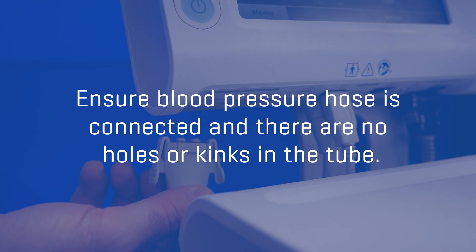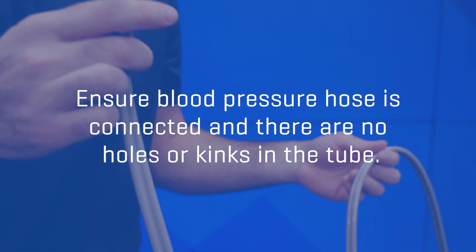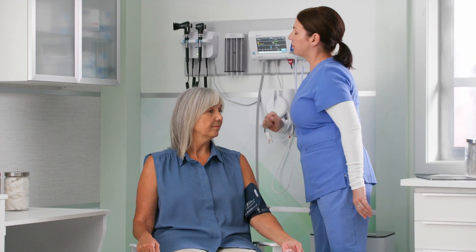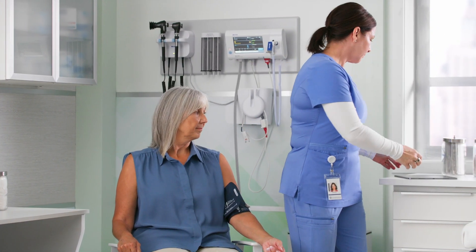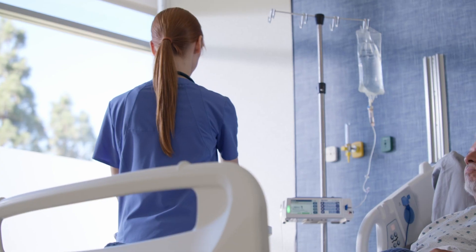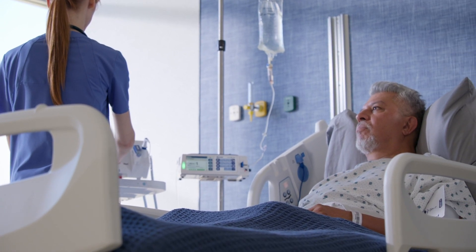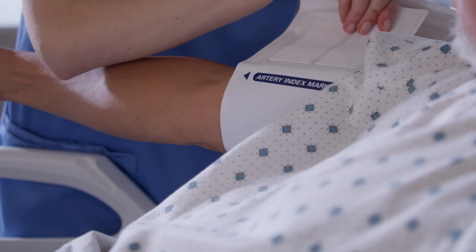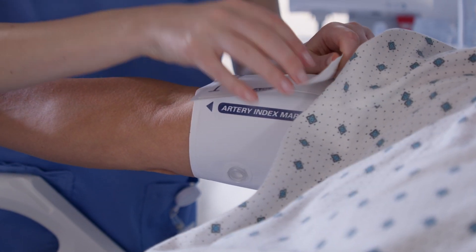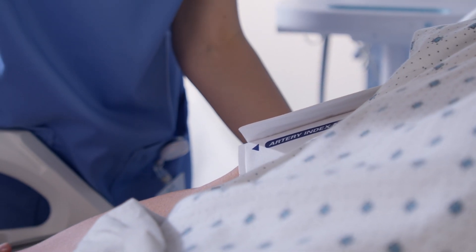First, ensure the blood pressure hose is connected and there are no holes or kinks in the tube. With dual lumen hoses, Welch Allen devices utilize our proprietary SureBP technology to acquire the patient's blood pressure on the inflation of the cuff in as little as 20 seconds. If a measurement is unsuccessful during inflation due to arrhythmia, patient movement, or other factors, the device will automatically initiate a step deflation measurement. If a single lumen hose is being used, the device will also utilize step deflation only.